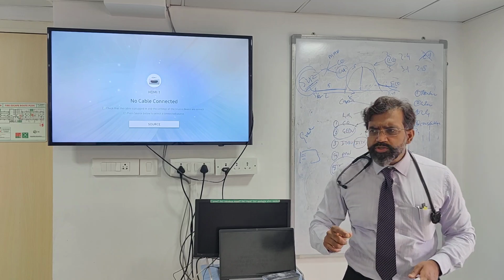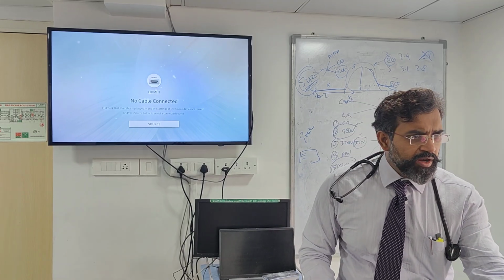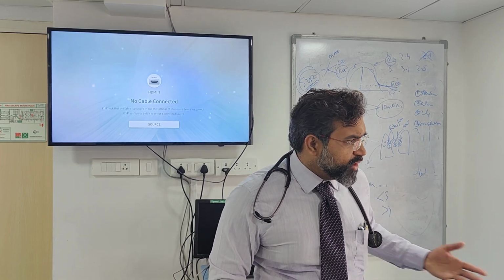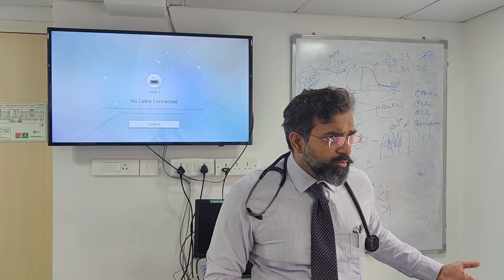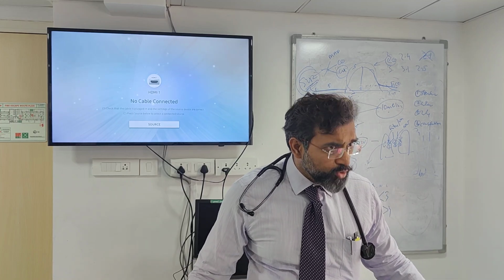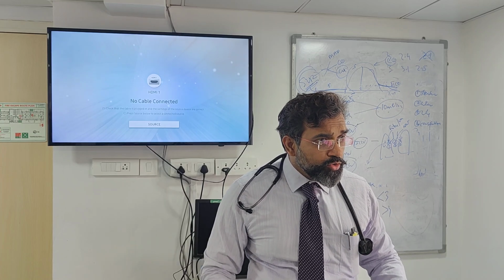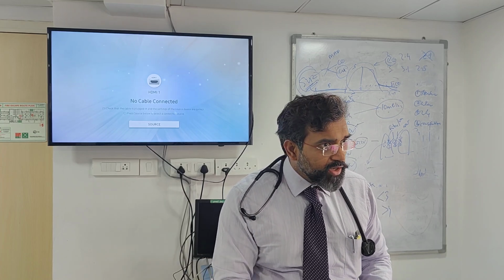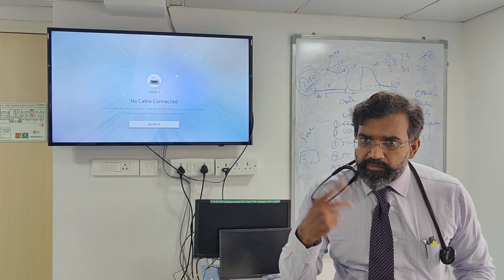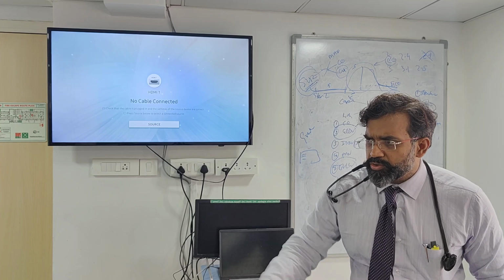You understand? So this can be used in various ways. For example, I give a small fluid charge of 500 ml. I don't expect 500 ml to dilute 65 liters of my body and cause fluid overload, right? If the heart is normal. 500 ml is not going into 65 liters and causing some problem. Should not have a problem, right? But I gave that 500 ml and the fluid overloaded. You have to understand whether it is leaky or whether really the hydrostatic pressure is too high. So once I give a fluid challenge, I repeat my EVLW, I look at my PVPI, I can kind of understand, okay, it's not a problem.